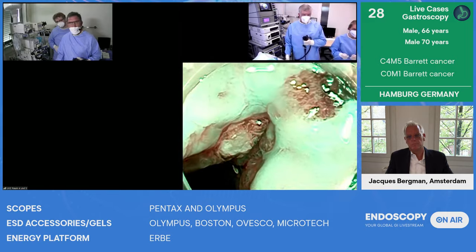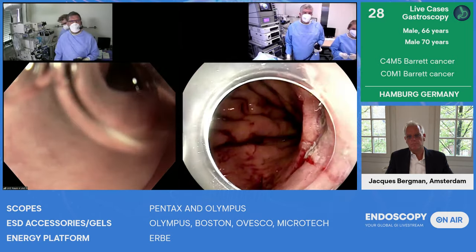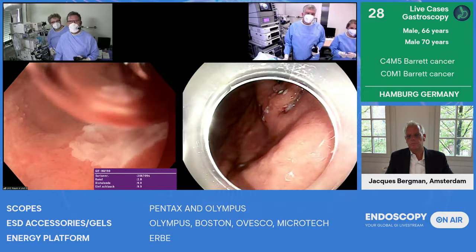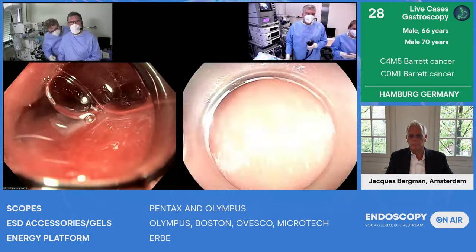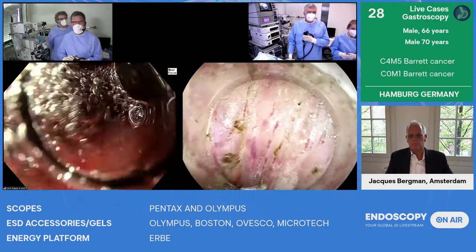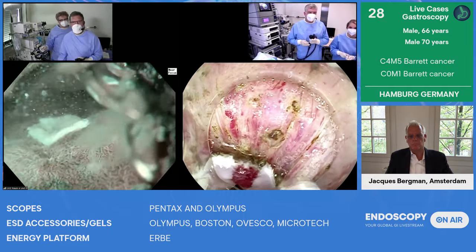And what we want to do before I give back to you is to show you that we have circumcised. You can also see it in a very nice retroversion function of the scope. And we want to show you a special injection solution before I hand over to you, lift up from Ovesco, which we have already used, but we'll use further.